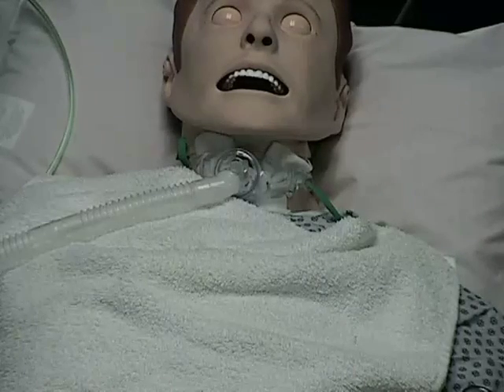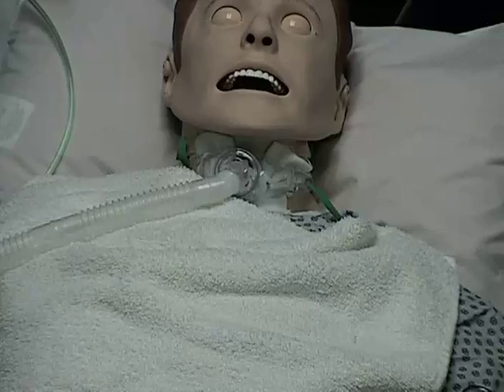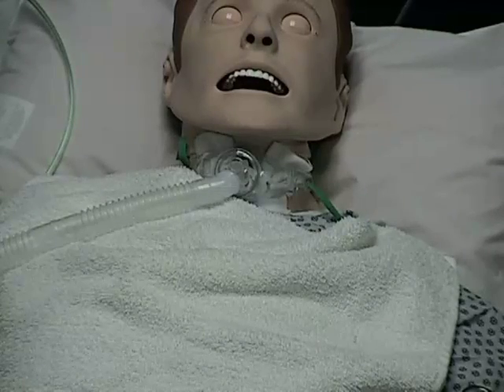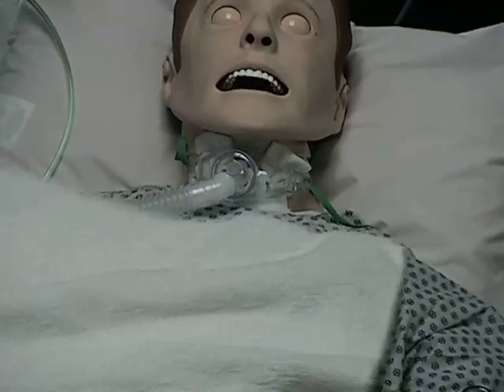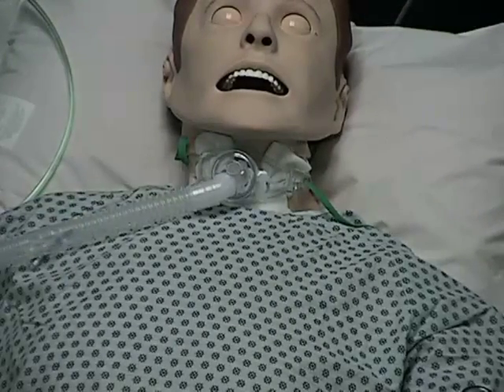Replace any O2 devices and remove and discard gloves. Ensure that trach ties are tied and perform hand hygiene. You have now completed Trach Care.